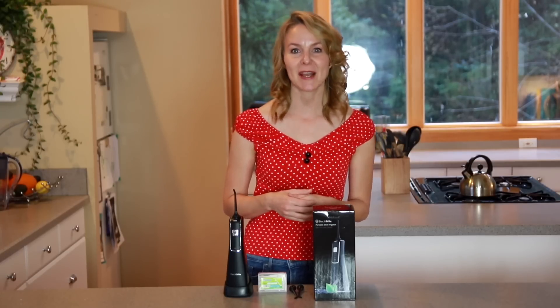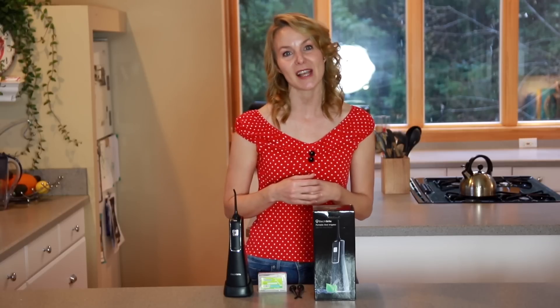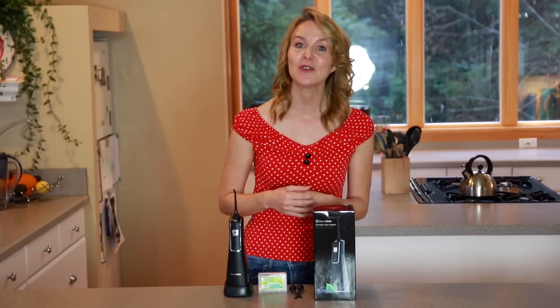The portable design saves space and is easy to carry in every scene, such as home, hotel, and outdoor travel. This is ElectriBrite's new handheld water flosser — check it out.